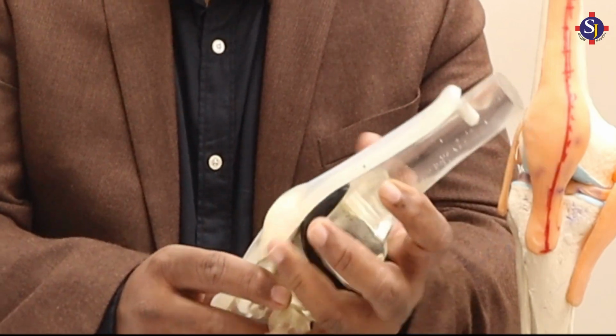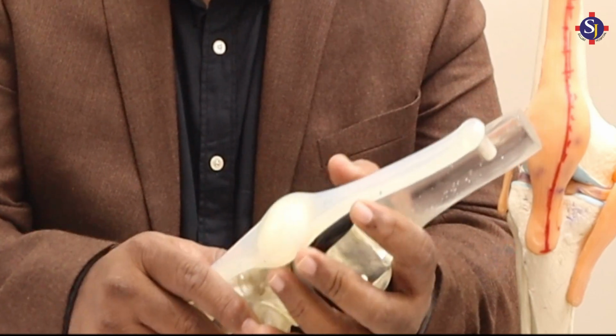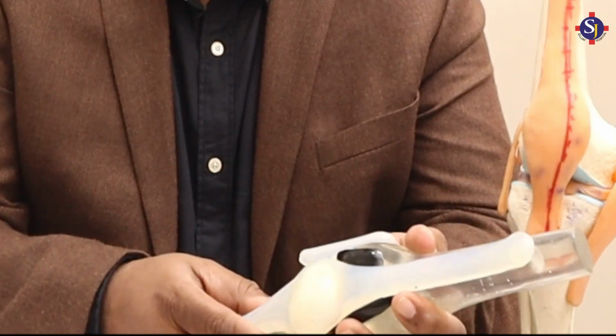And since the surfaces are very smooth, you get good movement. You can even squat and sit cross-legged. So that is the beauty of knee replacement surgery. The most important part about knee replacement surgery is that you become painless and you regain the freedom of your life. So that is how it has revolutionized the treatment of knee arthritis.